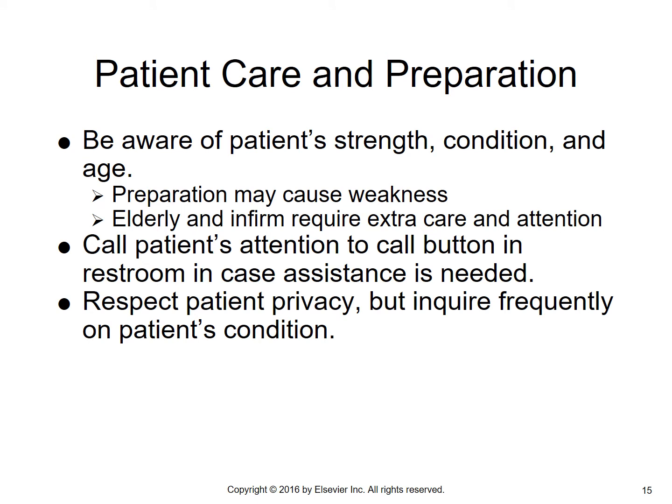Be aware of the patient's strength, their condition, their age. The preparation itself, not eating, just fluids only, can cause weakness. Elderly and infirm patients are going to require extra care and attention. They can't hold it as well. They usually can't turn as well as a younger person.